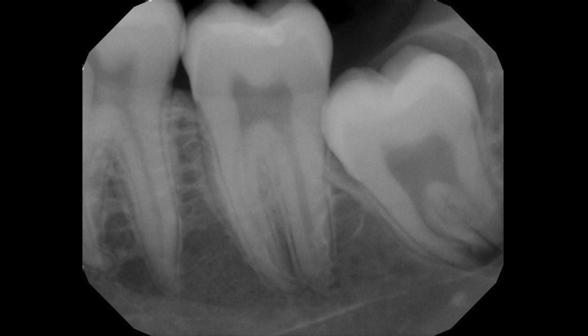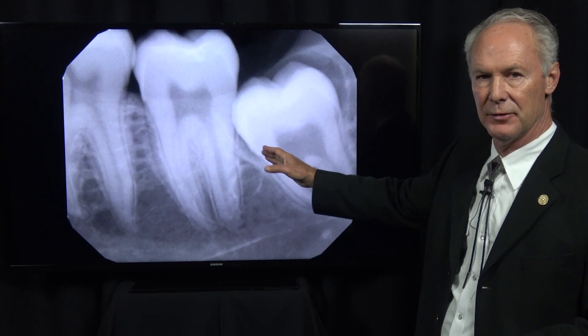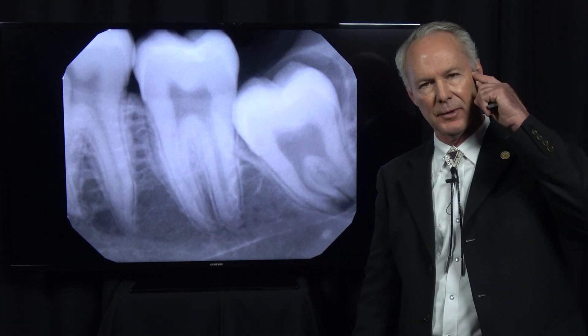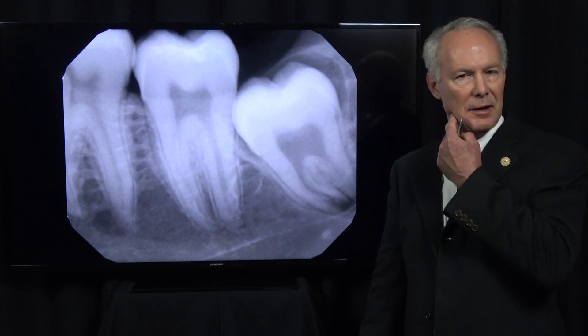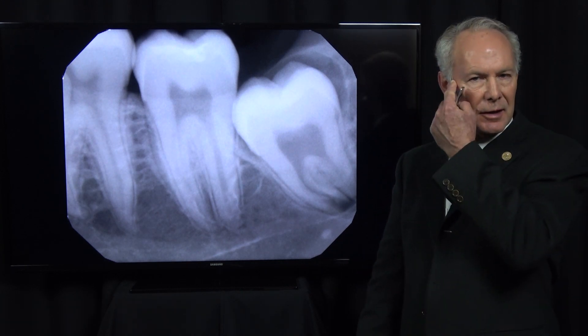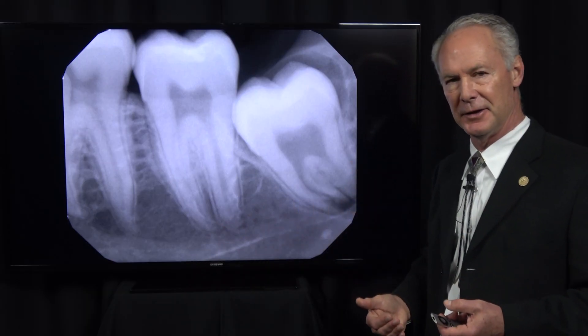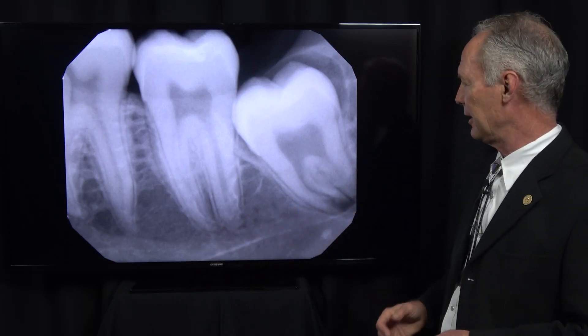We're removing the lower left wisdom tooth first. I always start with the lower left, then the upper left, then the lower right, then the upper right. I do the most difficult ones first — they're most difficult because they're on the other side of the patient. I'm on the right side, so the left side is harder.